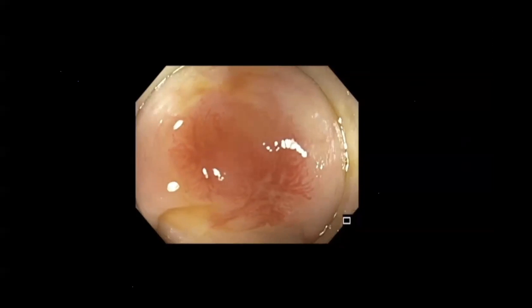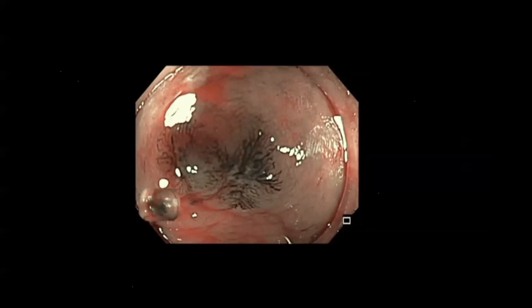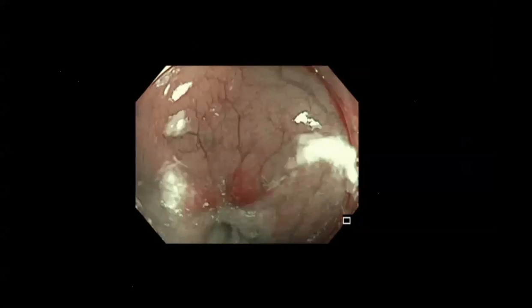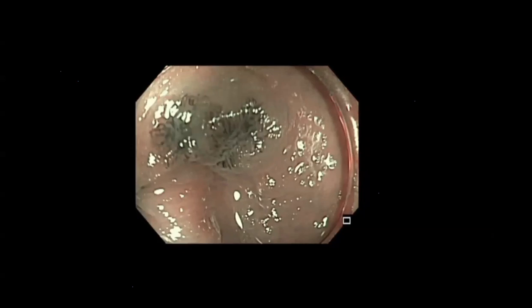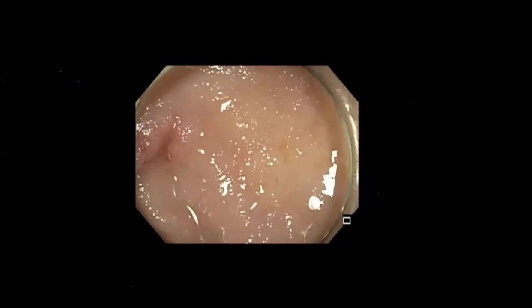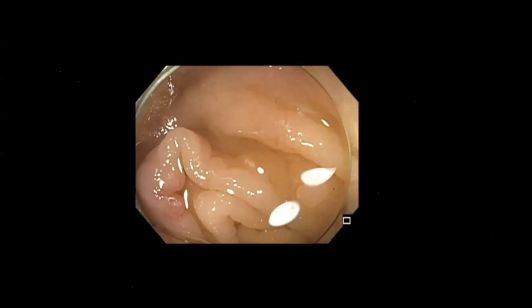So the key is, in addition to the angioectasia on the NBI, you can actually see a draining vein on the north side of this lesion. And you also notice that there is a little bit of soft tissue mass underneath that. So when you see something like that, you should worry about a larger feeding vessel feeding this angioectasia. As you can see, underneath the angioectasia, it looks like a little bit of soft tissue swelling.